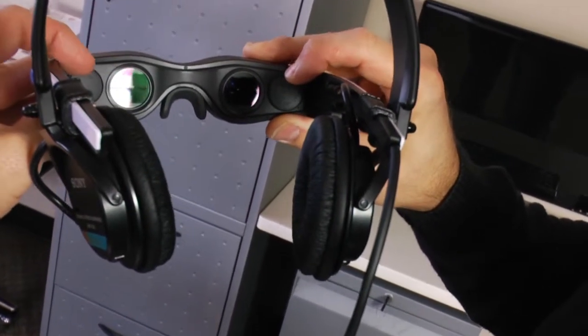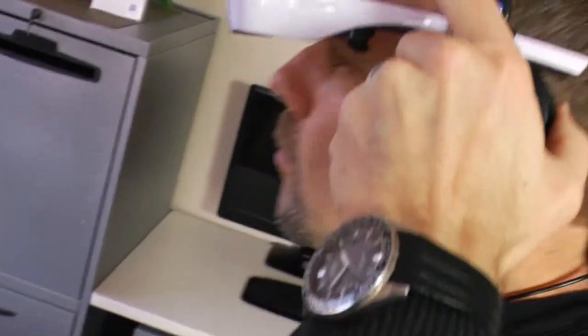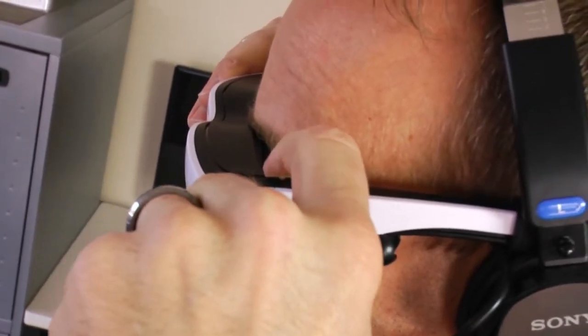Each eye can be individually focused on the Cinemizer by adjusting the focus wheel next to the viewing screen. There is an adjustment for each eye to ensure a crisp and sharp picture.